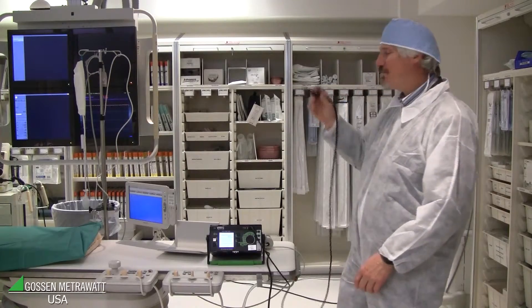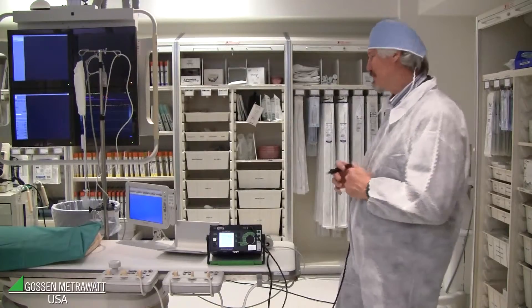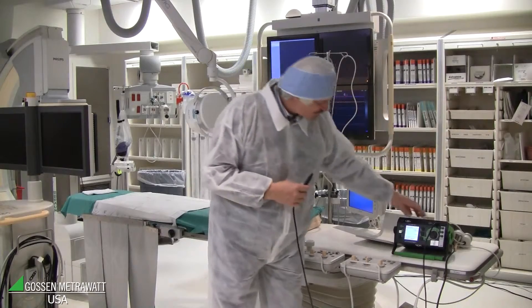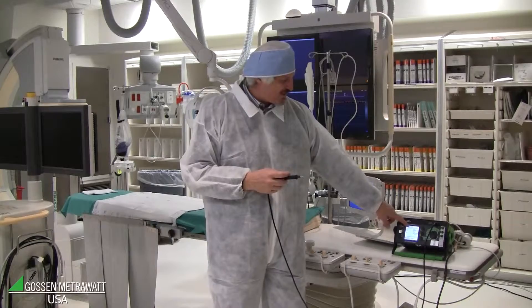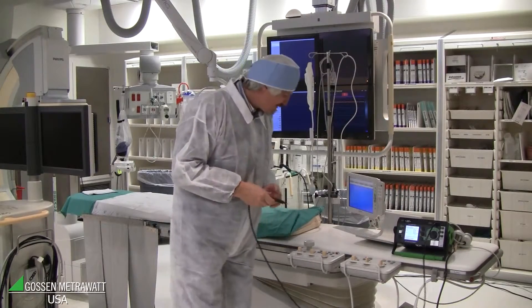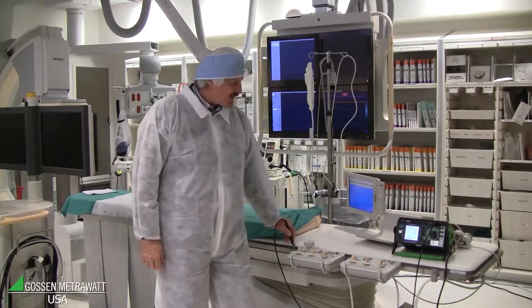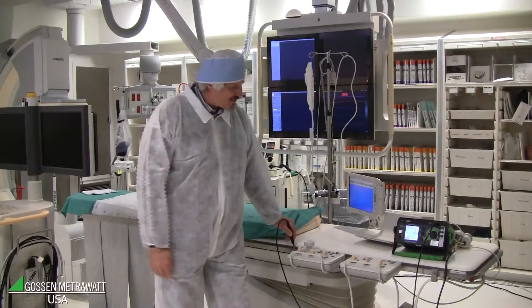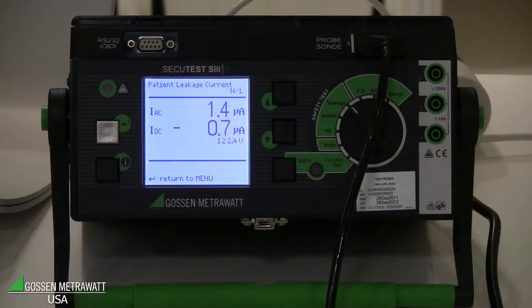I go through all the points in the instruction manual of the instrument. It starts with the RMS value, but I want to see AC and DC separately, so I push the button to show AC and DC. I touch the accessible part and can see AC is 1.5 microamps and DC is 0.8 microamps — both very low, below the limit.